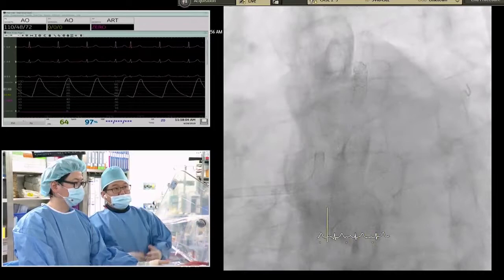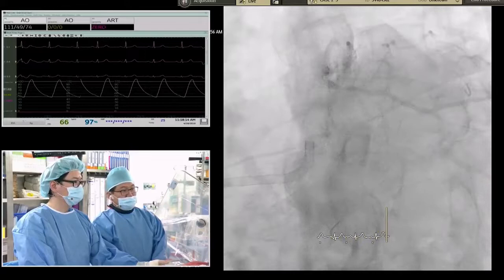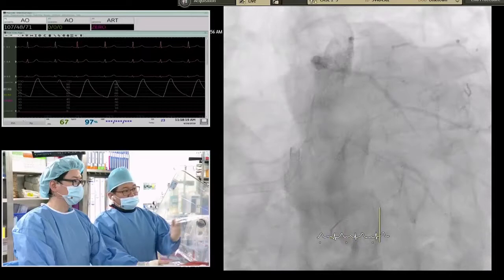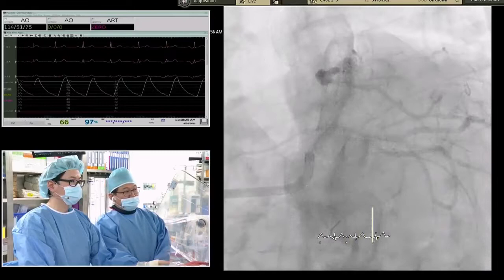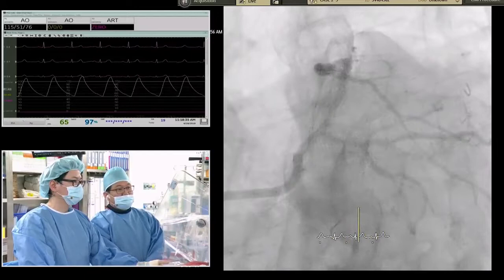Prognosis and patient symptom. Yes, if the circumflex FFR is negative, prognostically the circumflex is small, so not important. But during the procedure, considering the patient's symptom and procedural risk, the circumflex is not so small and very calcified. So initially, I agree with SJ, we need a two-stent technique, and IVUS evaluation is very important. So initially, we evaluate the LAD first.